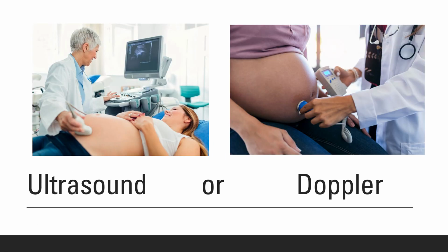As we talked about, there is a difference between an ultrasound and a Doppler. Normally, we don't always use an ultrasound, especially in the outpatient prenatal setting. They normally do this for your formal ultrasound, and if there are any complications with the pregnancy or the fetus, and they need better visualization of the fetus, the structures of the heart, or if there are concerns about growth restriction and things like that, an ultrasound is the best way to see what's going on with the baby.